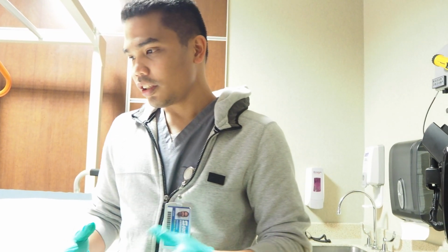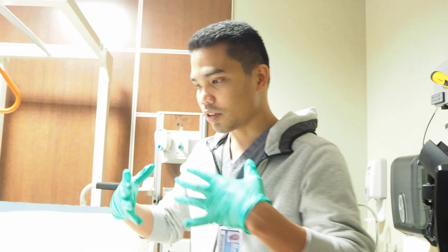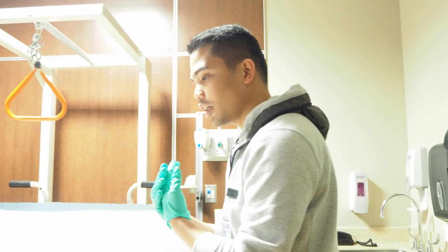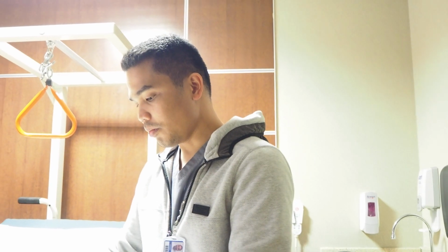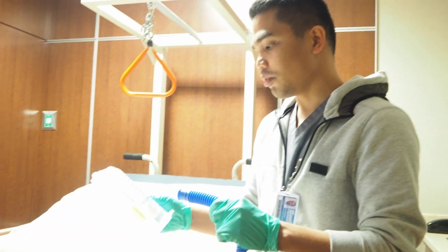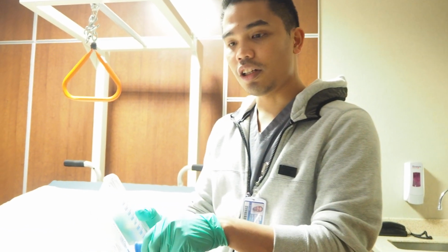If some patients just came from surgery and are still experiencing pain, we can put something in front of them, such as a pillow, where they can hold it like this, so that it would help aid or prevent any pain, especially if performing this device. So after doing those, every time we perform the therapy, inspect the device for any cracks, and then make sure we also demonstrate in front of the patient so that they would understand really well.